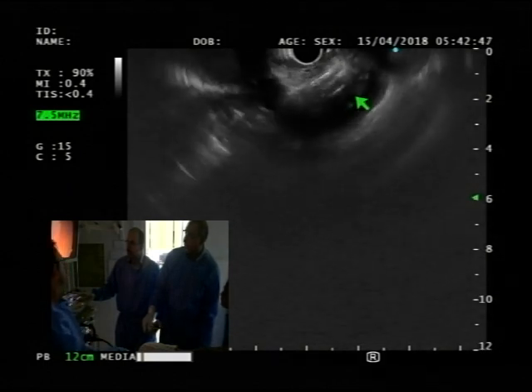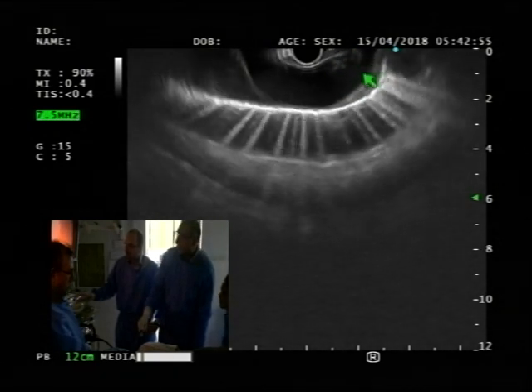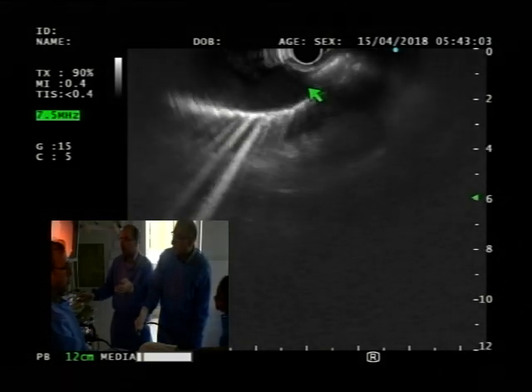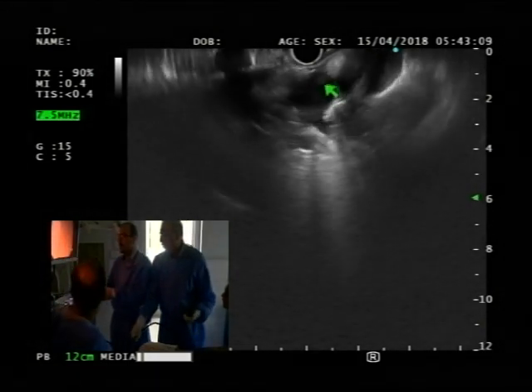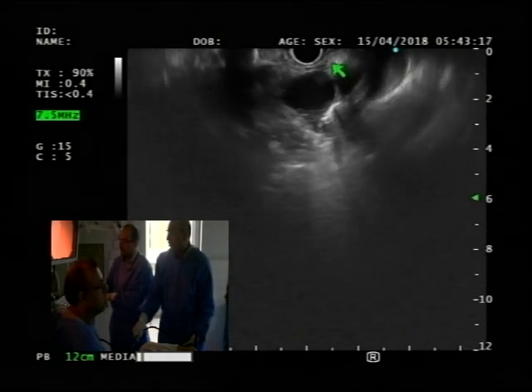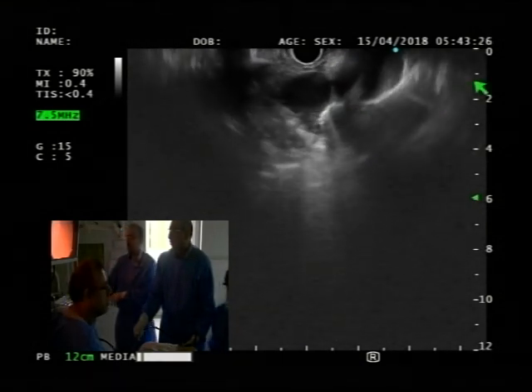Aorta, the descending aorta there. And now as you come back, you're approaching the arch. Once you see that the aorta is coming to an end, it's arching, you can stop. Big wheel towards you, advance a bit, and turn clockwise. And that will give you your two eyes. Aorta, pulmonary artery, and aortopulmonary window. Yeah, 4L, which is technically left lower paratracheal, and 5, which is your aortopulmonary. Okay? All right, good.